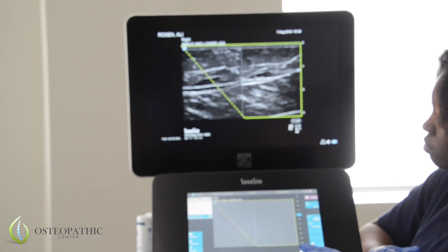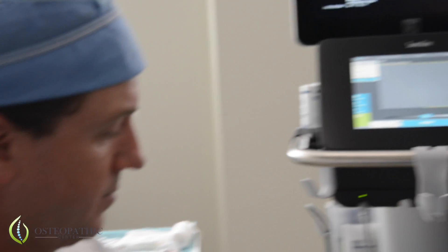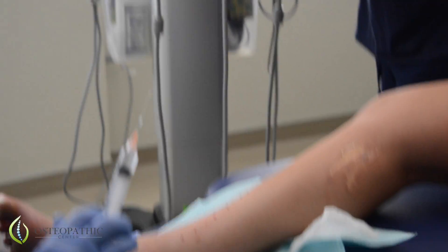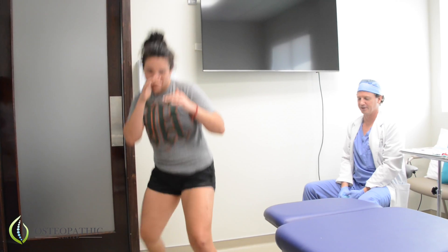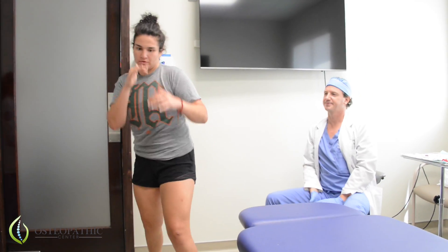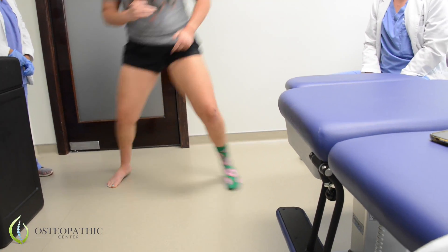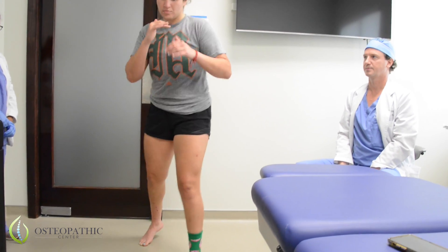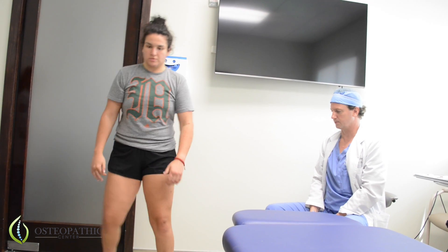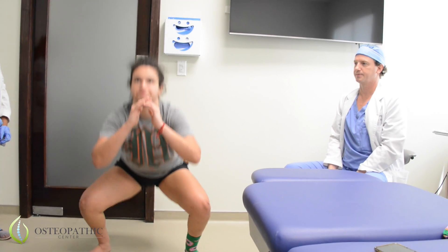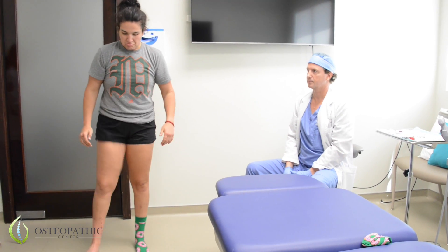I'm just separating the fascia where the tear has been identified. Oh my gosh, it's amazing — it's been months of excruciating pain. Is it 100% better? I would say so. Move all kinds of directions. Let's see if I can squat. Push it. Yeah, I'd say so.